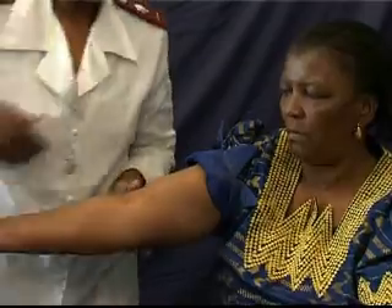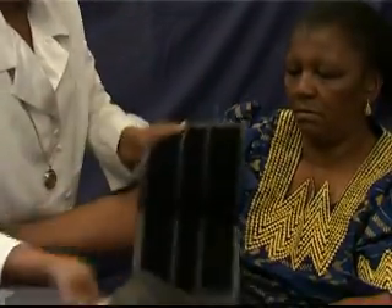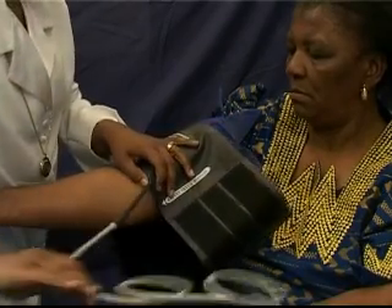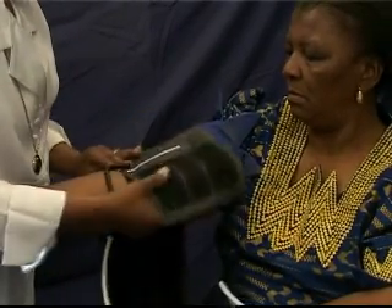Should it not be possible for any reason to use the left arm, then use the right, as long as, in general, the same arm is used on that patient, as pressures can be different for the left and right arm.